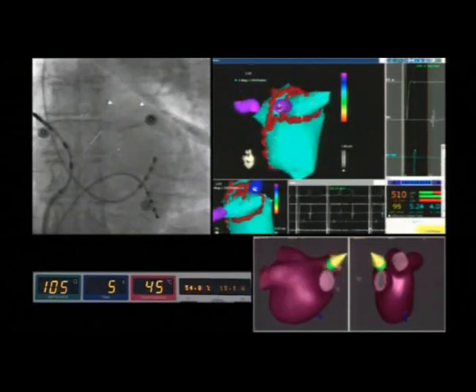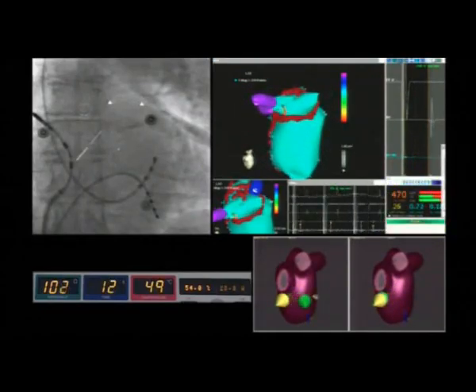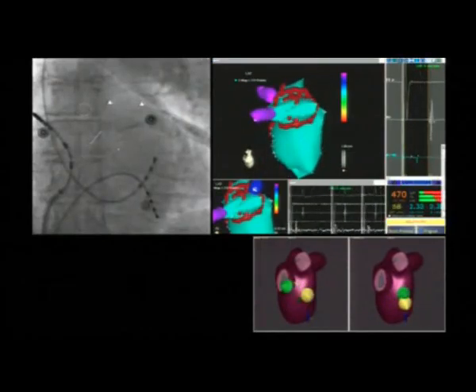Given here, like with the left-sided pulmonary veins, when possible the operator performs a line separating the right superior pulmonary vein and the right inferior pulmonary vein.